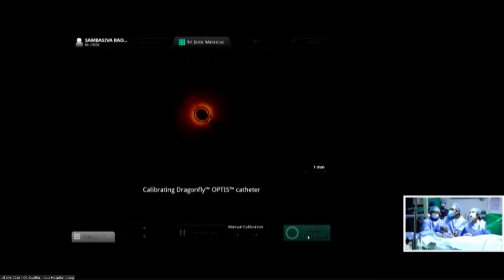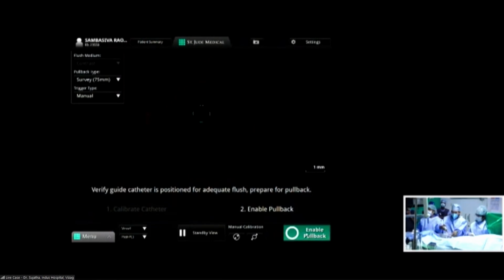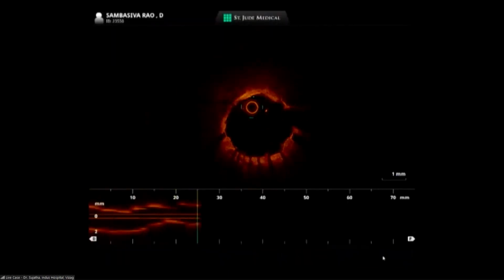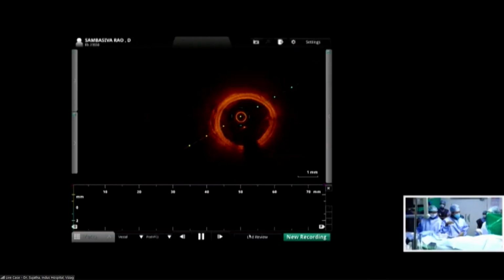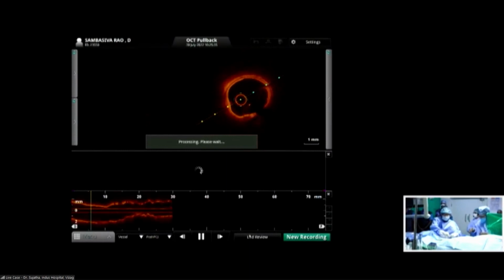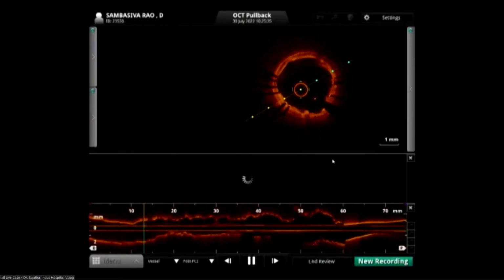Yeah, check. We are inside. Okay. Right? So we are taking the OCT run. So you can see the OCT run and tell me what I'll be doing. Krishna will be showing us what we've done, whether to remove those.